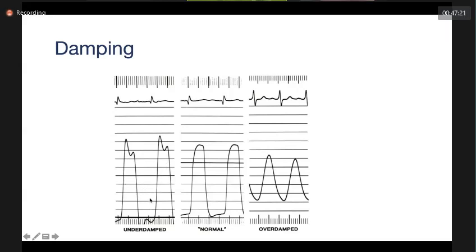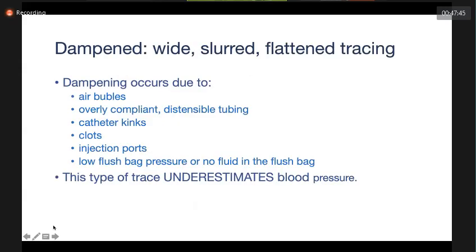You create a little bit of bubble here. You put a small bubble here to optimize the damping so that you can eliminate this overshooting of the pressure wave. Whereas here, because of clots or leaking of the pressure in the connectors, you have this overdamping, so you need to check the connectors and check for clots and other things.